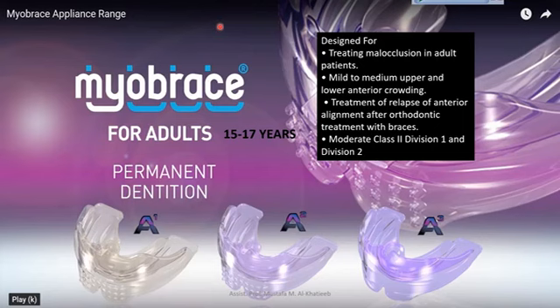The Myobrace for Adults, as we said, is used between 15 to 17 years old for the permanent dentition, designed for treating malocclusion in adult patients: mild to medium upper and lower anterior crowding, treatment of relapse of anterior alignment after orthodontic treatment with braces, moderate Class 2 Division 1 and Class 2 Division 2.